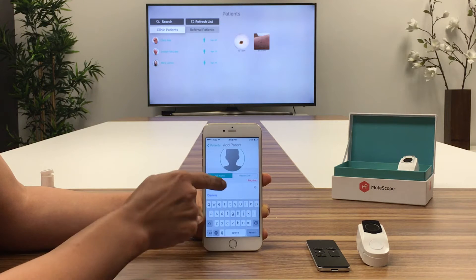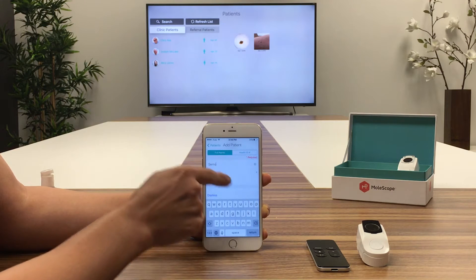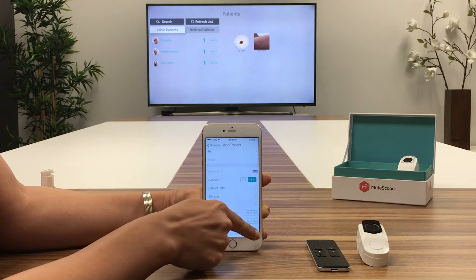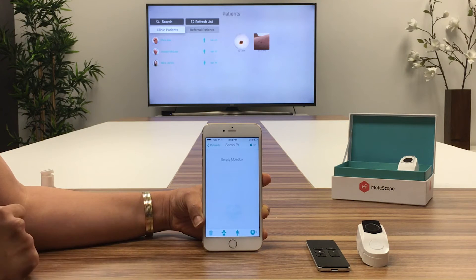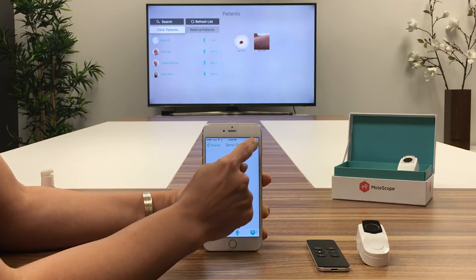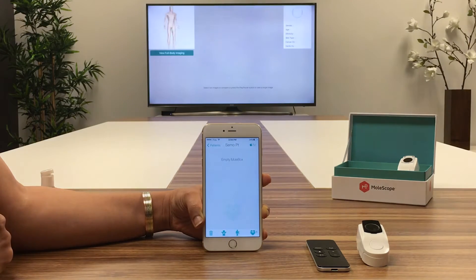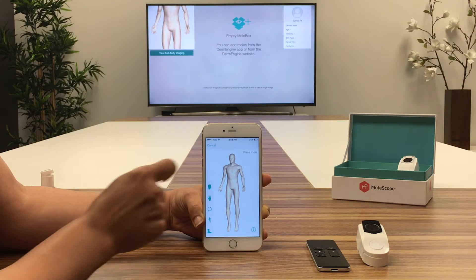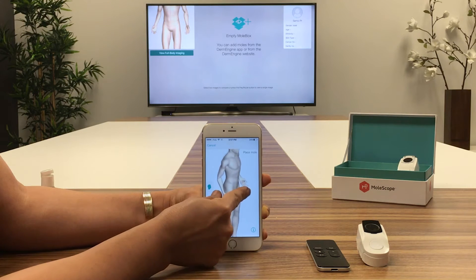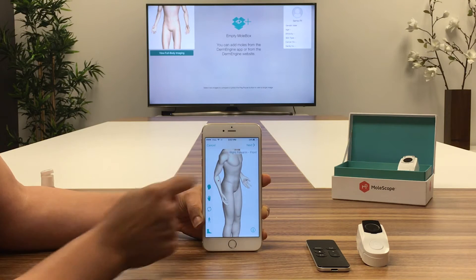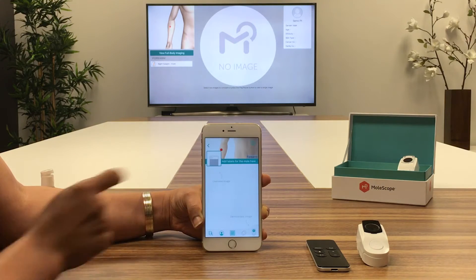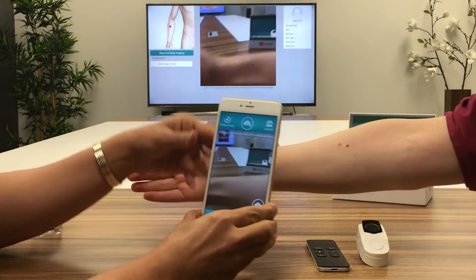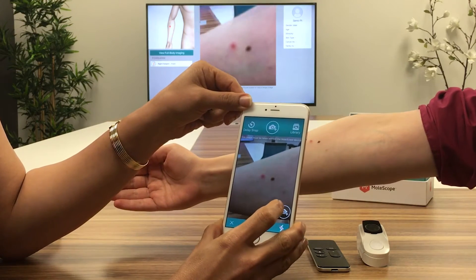DermEngine's Apple TV app communicates seamlessly with your smartphone. A new patient profile can be created on your smartphone and displayed on the TV. DermEngine's lesion tracking features simplify image archiving and management by organizing patient lesions on a 3D body map. Actions performed on your mobile phone are live-streamed and displayed through the Apple TV.